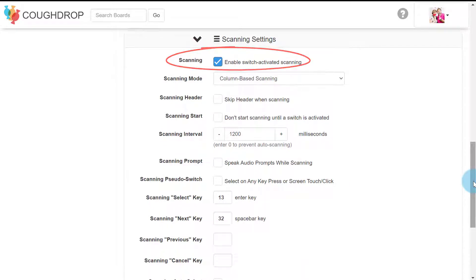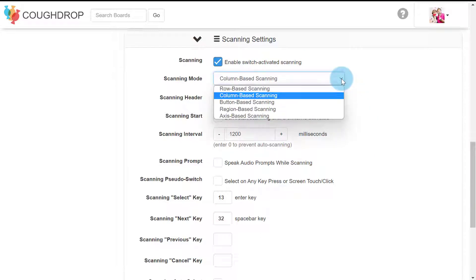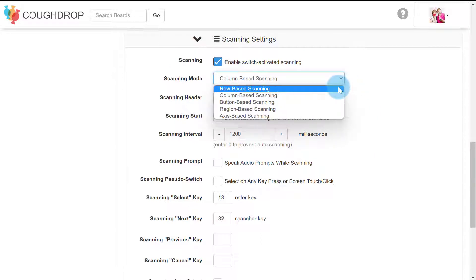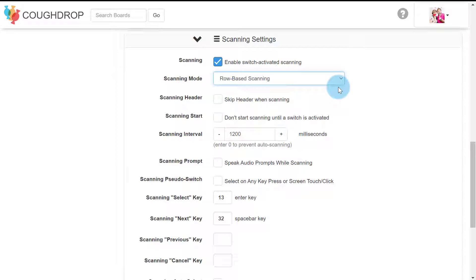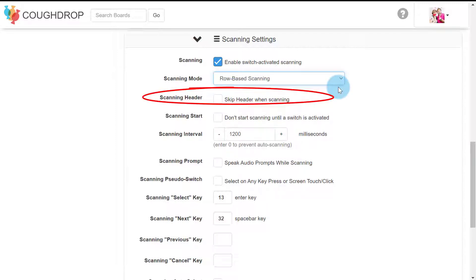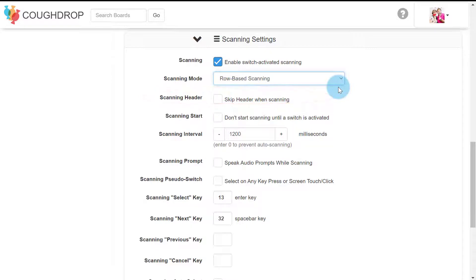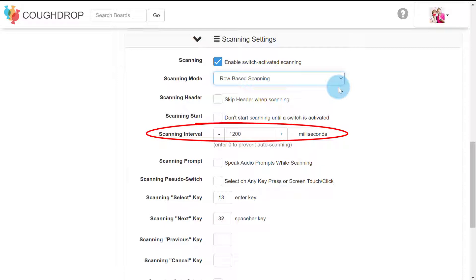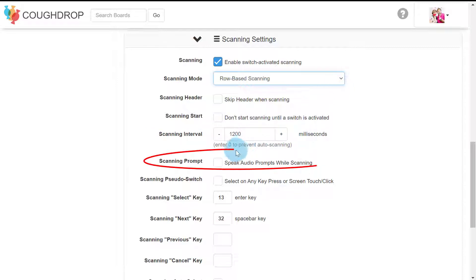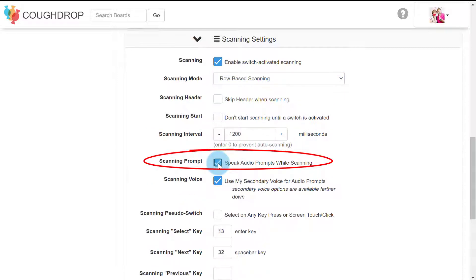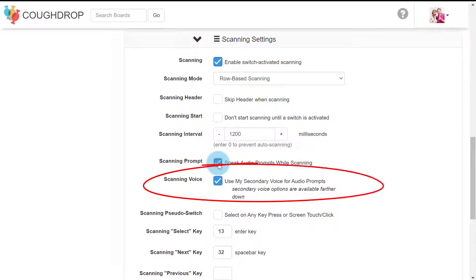You can choose how you would like the system to scan speech boards for your account: row by row, column by column, button by button, or by region. You can choose to include or skip the header when scanning. It is also possible to adjust the speed at which the system scans items, set up audio scanning, or even use one voice for audio scanning while another voice is used for selected vocalizations.